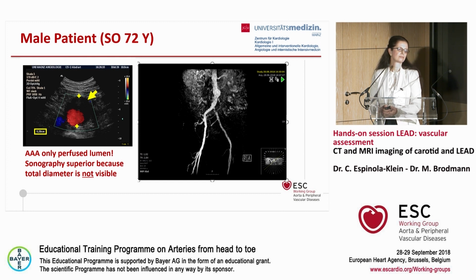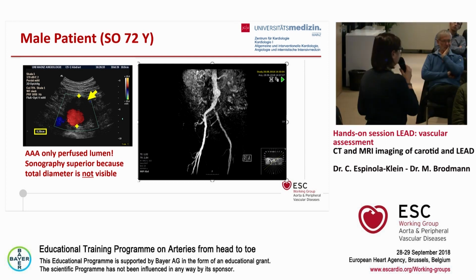So, does anyone want to comment on that? We are usually performing sonography for follow-up. Yeah. Who would do it the same way, just sonography? Raise your hands. Okay, so that's the majority.